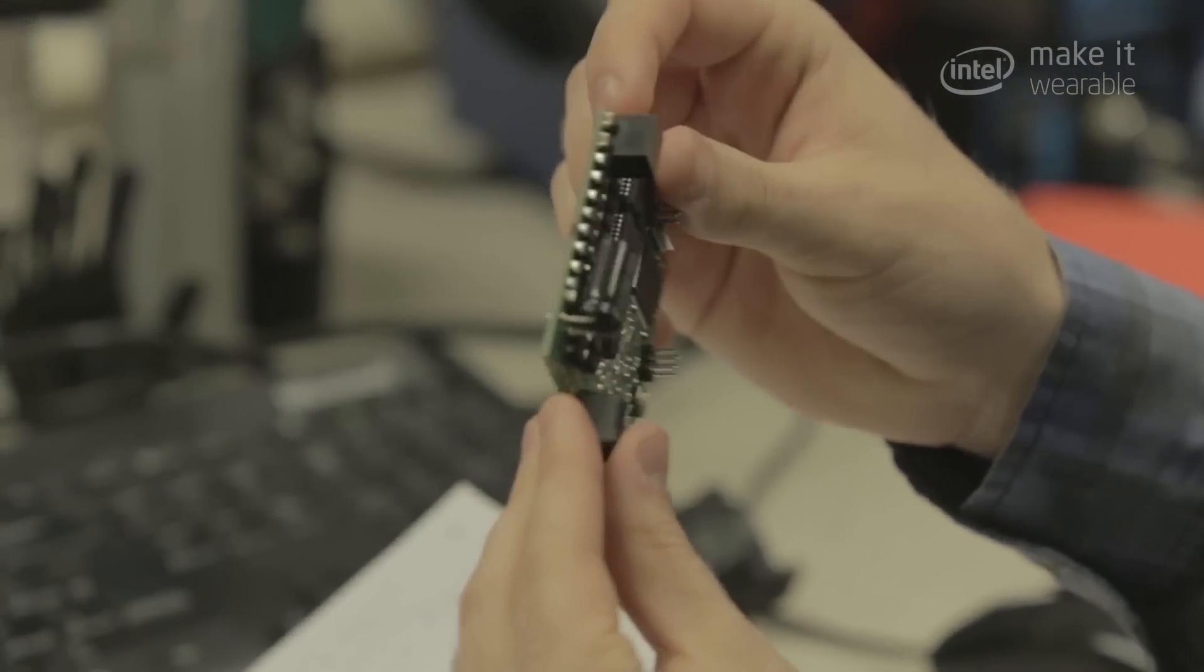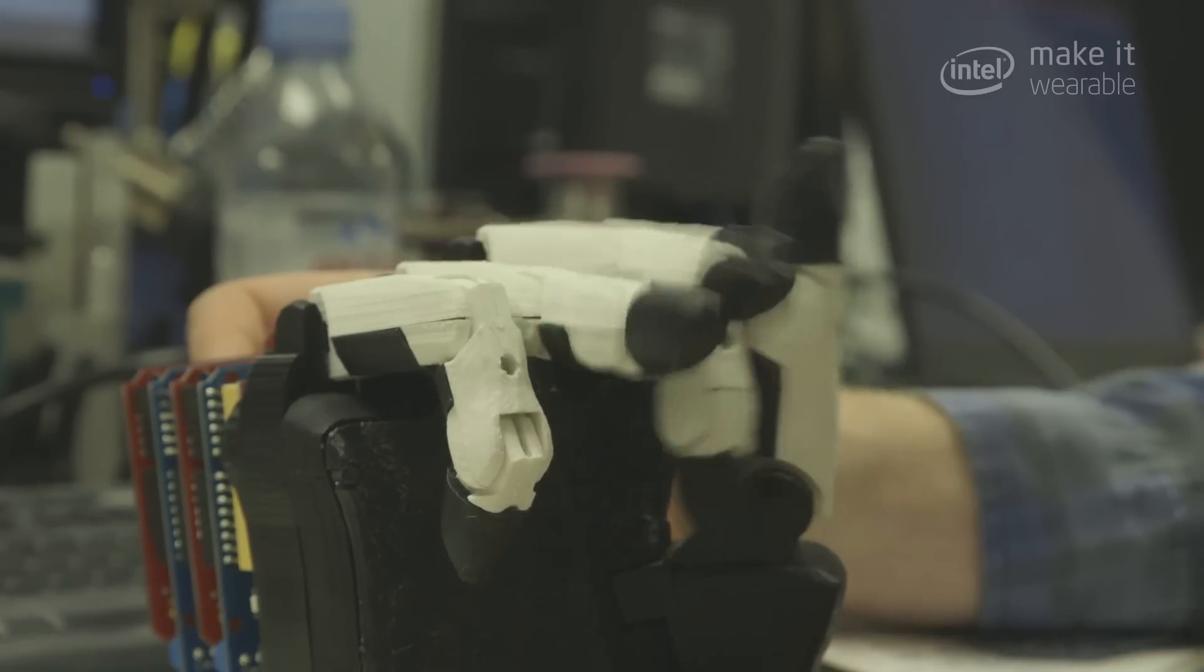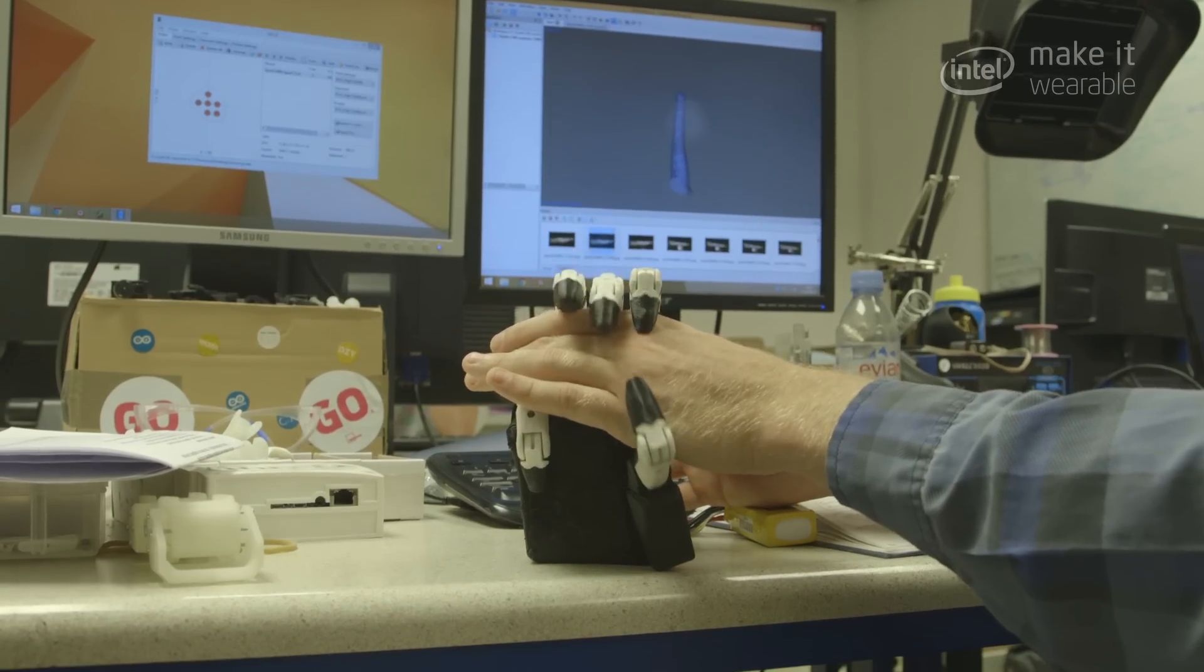This chip is going on to our circuit board and it's going to be used to control the motors of the hand and do some processing on the signals that the amputee inputs.